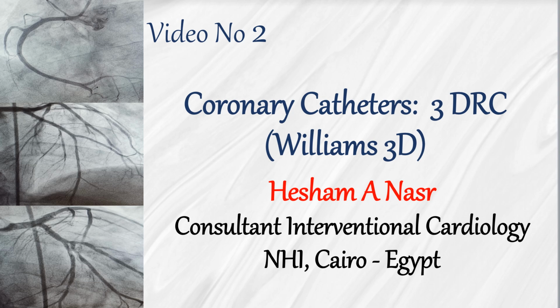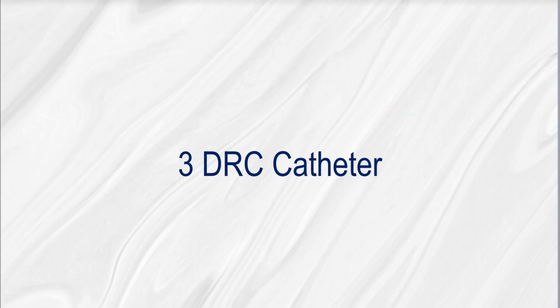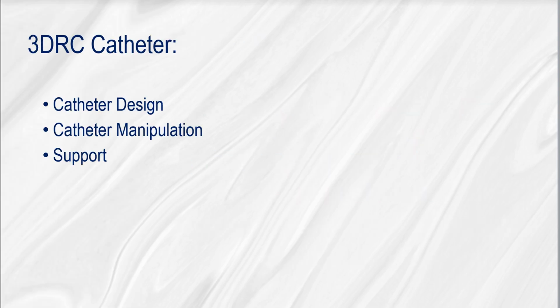Welcome back. This is video number 2, coronary catheters 3D RC. We will discuss catheter design, manipulation, and support.